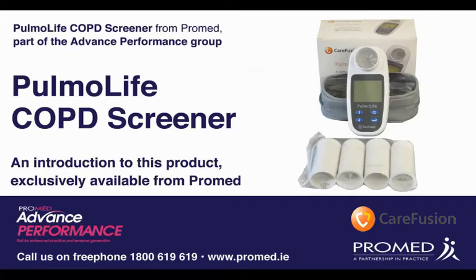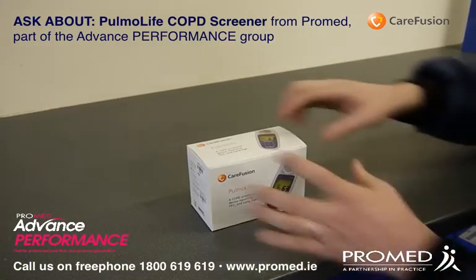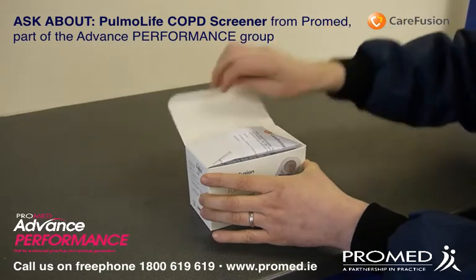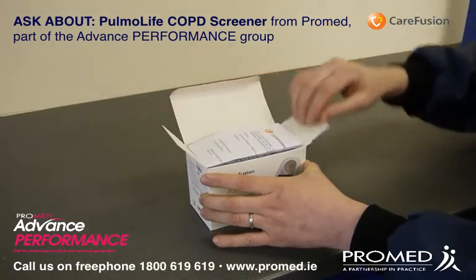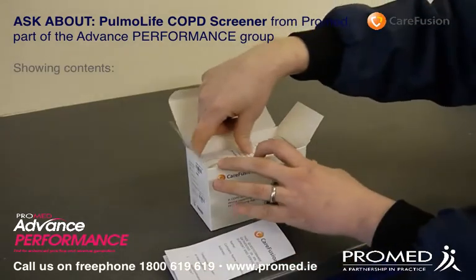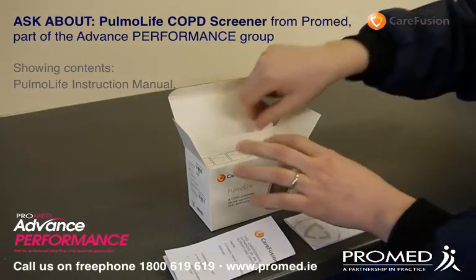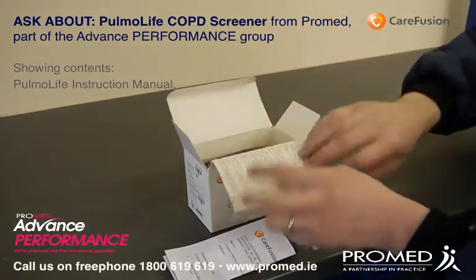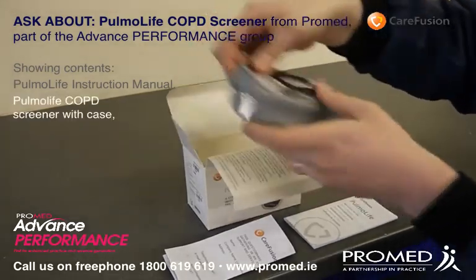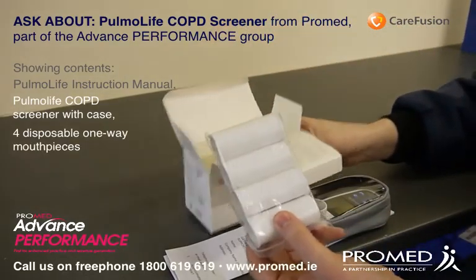Introducing the Pulmolife COPD screener from ProMed. The package includes the following: the Pulmolife instruction manual, the Pulmolife COPD unit itself with a case, and four disposable one-way mouthpieces.